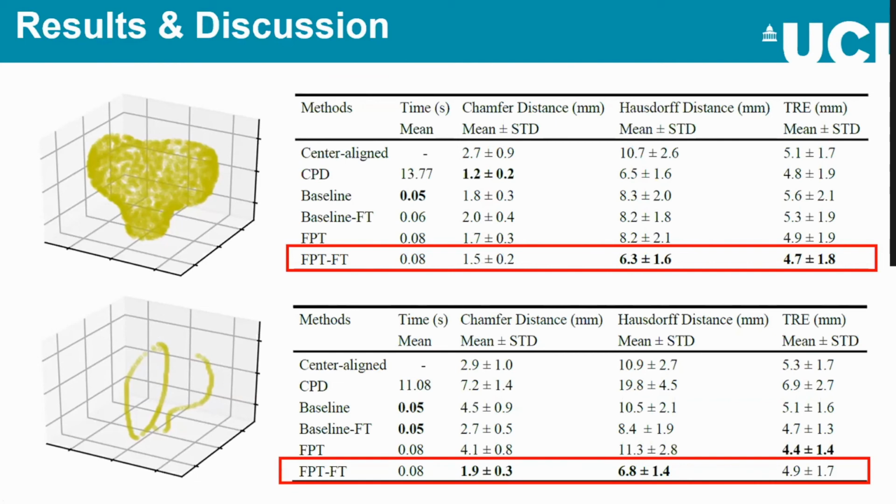And using just this geometric and spatial information, we can use next to no amount of data compared to an entire image volume and still be able to have a fairly successful registration from basically an instantaneously acquired ultrasound slice. So it's also unclear as to whether or not traditional image or intensity-based methods would be able to perform with this sort of lack of data that we've been able to leverage here for making use of our network.